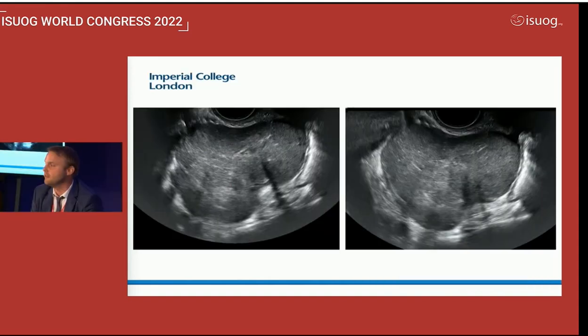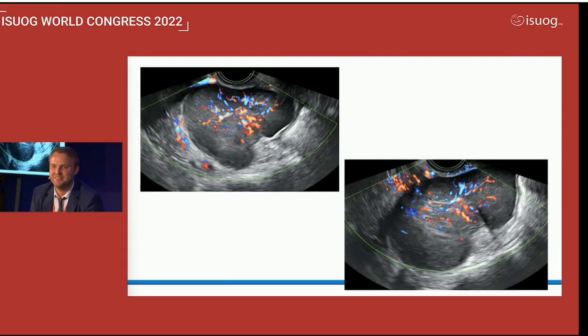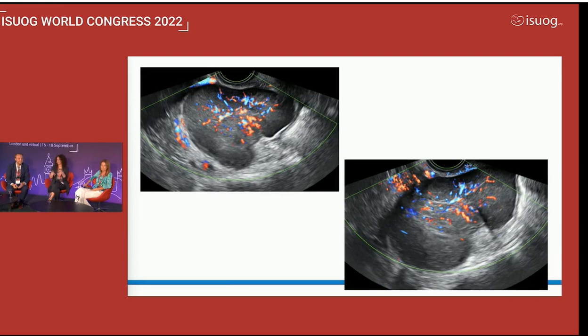But there are some shadows there. There are shadows. The shape is a little bit... And no fan-shaped shadows. And high vascularity. Vascularization is very... What about an immature teratoma? No. Is it bizarre? No. Bizarre in a different manner. Do you see tortellini?